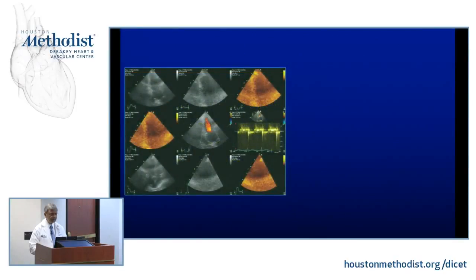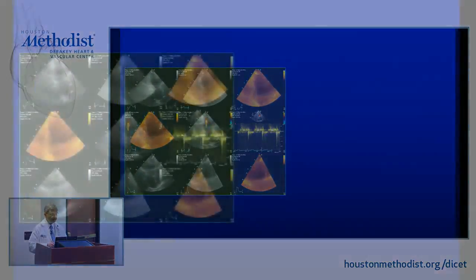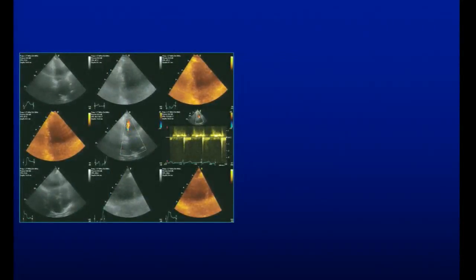So let's go through some examples. Well, if you take a look at this heart that gradually will start moving, you can't tell a thing. I mean, I can poll you and you could take any. I'm amazed, actually, if people are seeing such a thing and are not using contrast in their own laboratory, how would they interpret such a study? Would they interpret it as completely uninterpretable? And to tell you the truth, many people will.